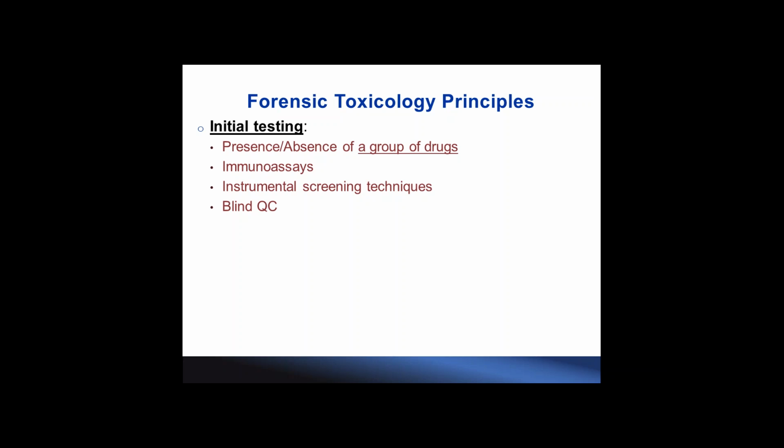And when we review the data, we would look for that particular sample matching up the expected test results. So if that test result appears in a different sample ID, we would know that there is some sample switching happening during the process, and the whole batch needs to be redone with a separate aliquot of the samples. This is the whole redo process. So if this batch is valid, the samples that are negative for drugs will be released as negative.